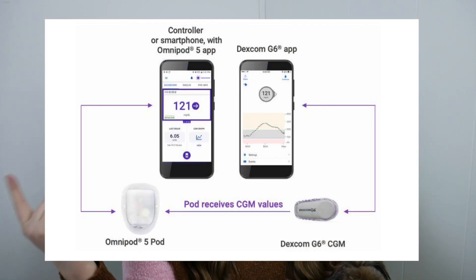One thing that can be a little confusing when first learning the Omnipod 5 is the two different apps. You have your Omnipod 5 app and your Dexcom app — they don't directly communicate with each other, but communicate through the sensor and the pod. You'll use both apps: the Dexcom app is where you start sensors, troubleshoot sensors, and acknowledge alerts; whereas the Omnipod app is where you start pods, bolus, and acknowledge pump alarms. It will still alarm for blood sugar under 55, but otherwise they have different jobs, and interacting with both apps is required.